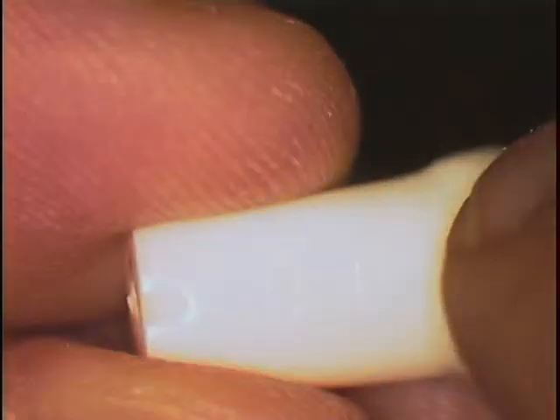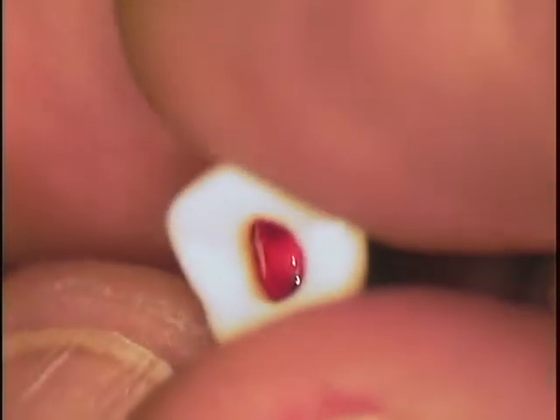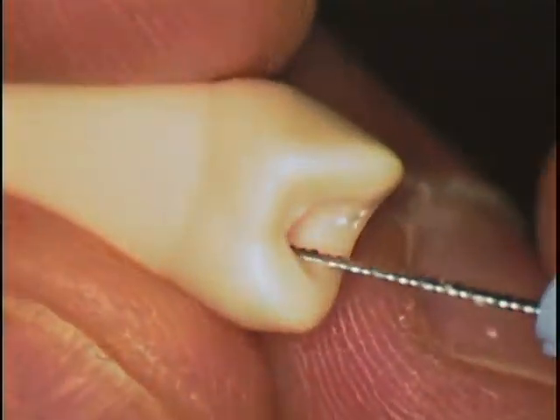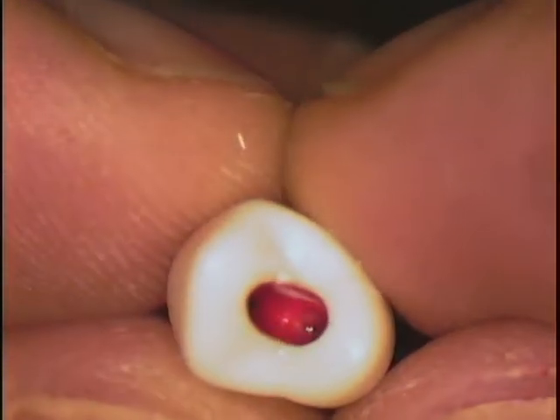There's a certain amount of constriction that you'll find in the middle of the root canal itself that needs to be flared. So don't think you're going to create it near the apex. Try to remove some of that debris from the middle of the canal itself by simply pulling it up on the side, quarter turn, and pull out. You see the debris is at the mid portion of your file, not at the tip. And so you're funneling and creating this funnel shape. That's the goal.